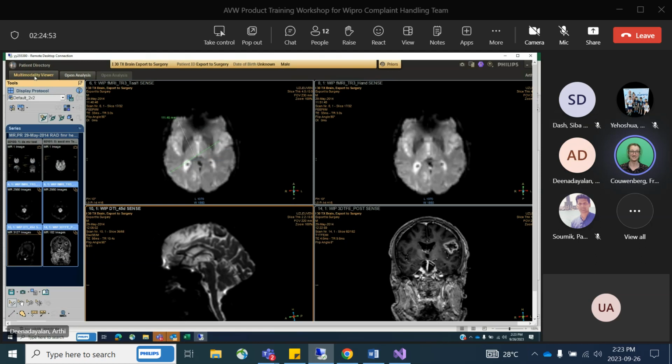Could you please show what the intended functionality of the film is? So you now showed how you make it, but why would you use that?